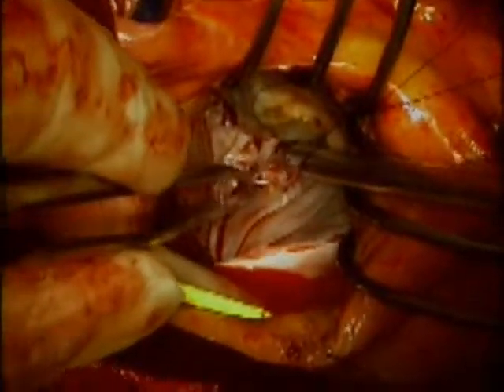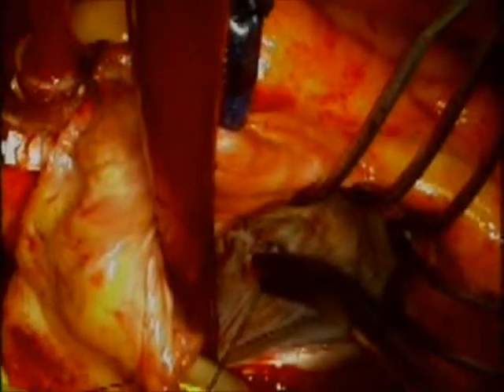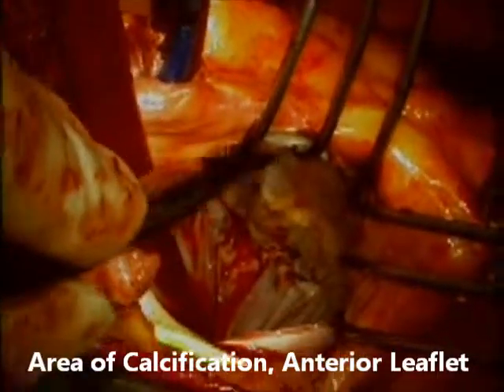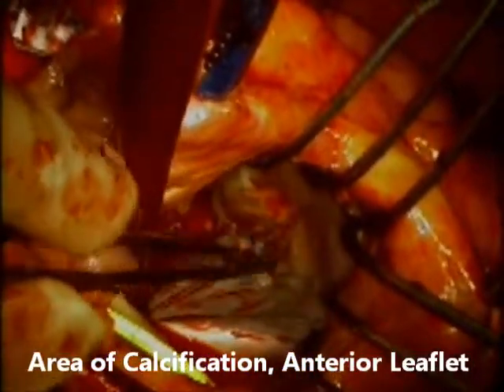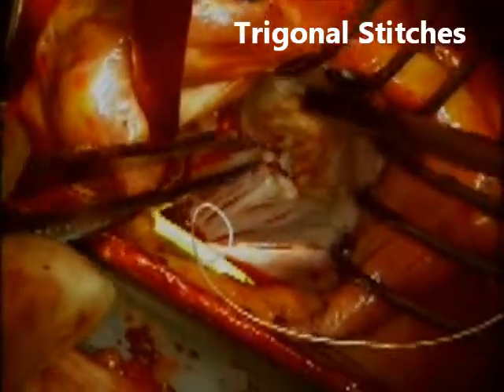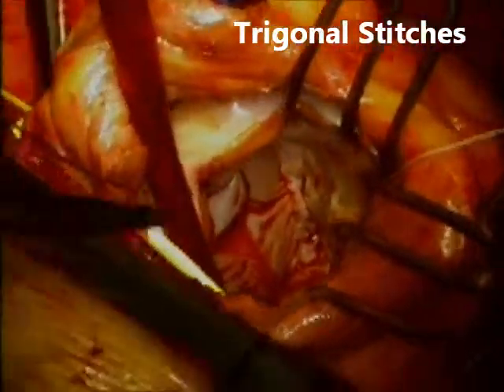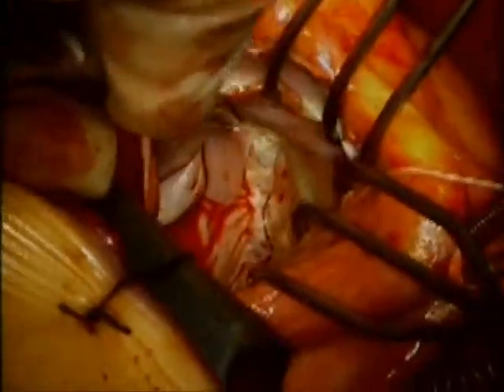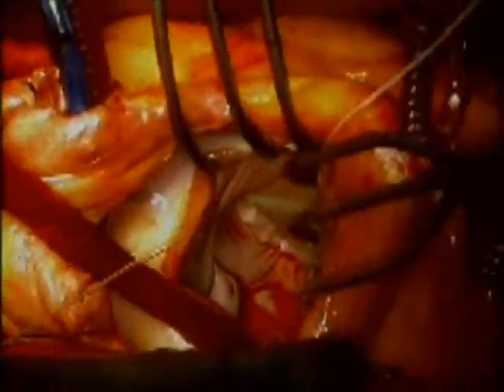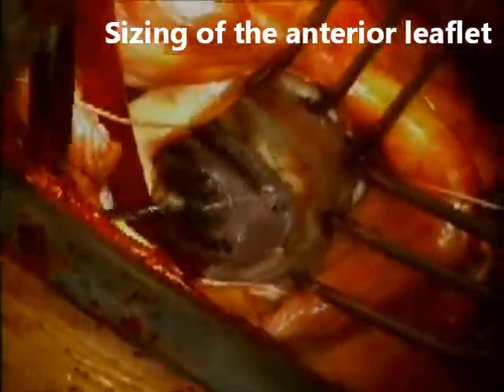If it is a very flimsy leaflet I might use 5-0 prolene; otherwise, as in this case, I use 4-0 prolene. I am showing you the area of calcification on the anterior leaflet and identifying the trigonal area. It is a very important stitch — you must learn to recognize where the trigone is, otherwise the stitch might go through the atrial wall or through the leaflet, and you miss the fibrotic, mechanically resistant portion of the trigone. Once I place the stitches I tug on them slightly to confirm they are resistant to traction. At this point I size the anterior leaflet, which appears suitable for a size 28 annuloplasty band.